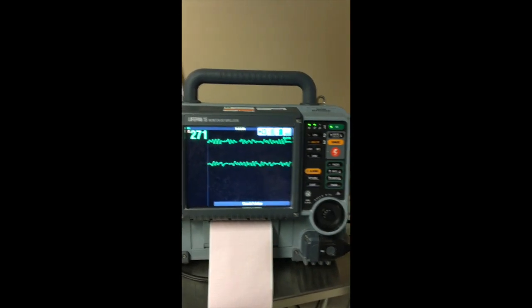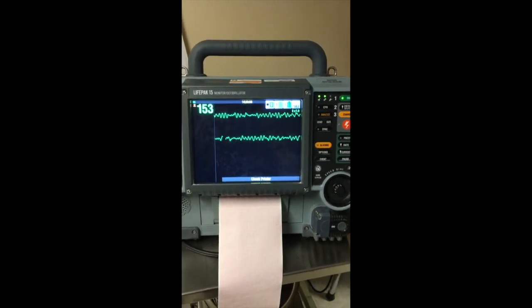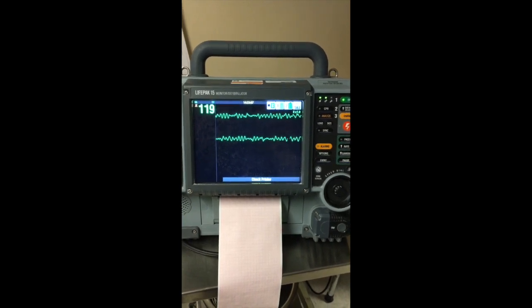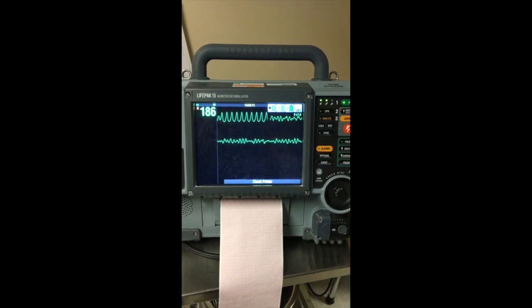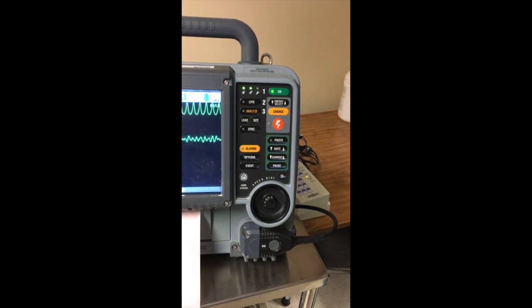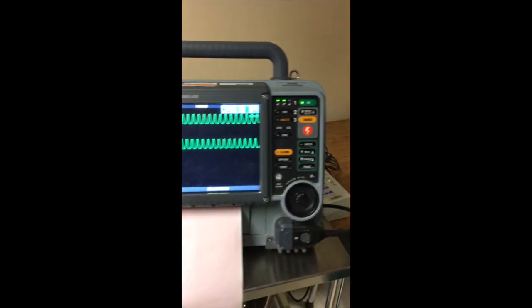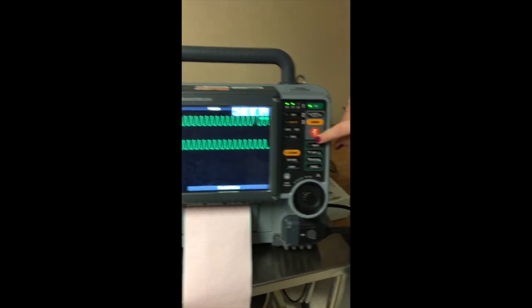If it's a shockable rhythm, anytime you have a shockable rhythm, either VFib or pulseless VTAC, immediately go to your gray box and shock them. Anytime, during any event. If this shows up, VFib and pulseless VTAC, go to your gray box and start at the top and go down.